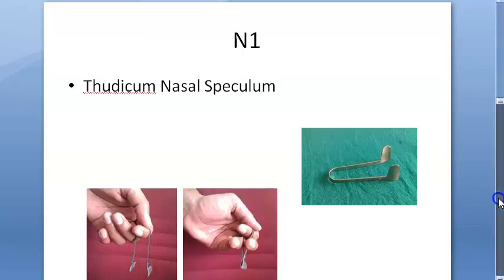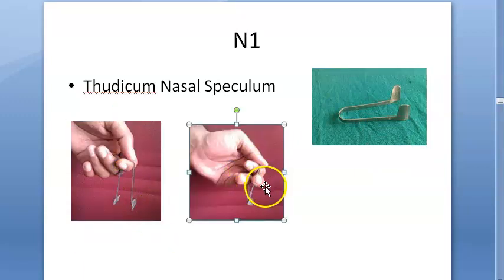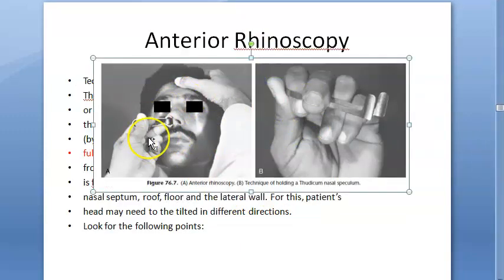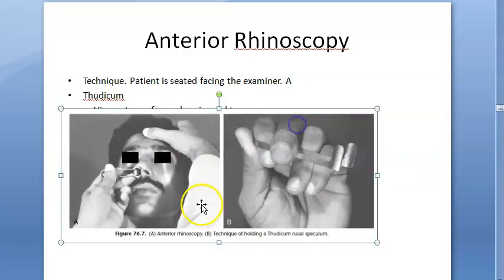Let's look at some nose instruments. Basically, here you have the Thudicum nasal speculum. How do you hold it? Put it on your left hand's index finger, then the middle finger goes outside, the ring finger comes inside, and these two fingers press so that you can make it small and big. You will use it to do anterior rhinoscopy. When inserting it, you have it fully closed.